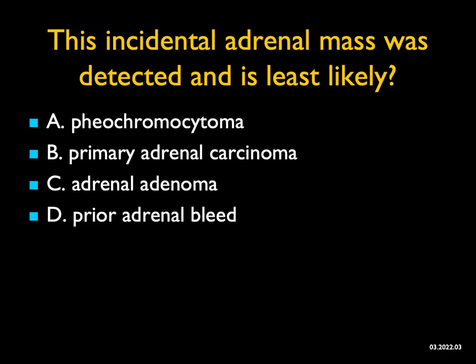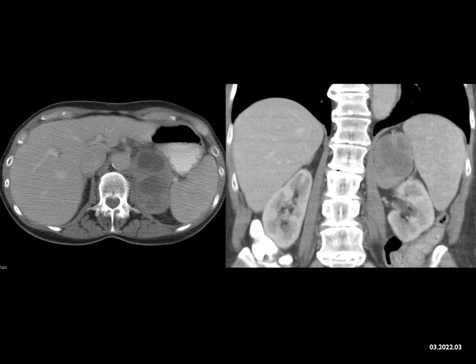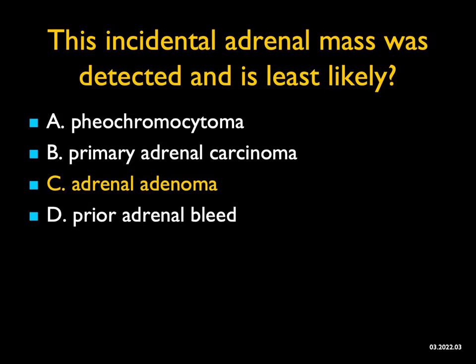The incidental adrenal mass was detected and the question is what is least likely. I see a large, complex, solid and cystic lesion in the left adrenal gland. My best bet would be maybe a cystic pheo, but it's not very vascular — though this is not a great injection. A primary adrenal cortical carcinoma is a good possibility. A prior bleed — cystic, low-density — if you had an adenoma that bled or some other lesion that bled, that would not be bad. The least likely thing to me is an adenoma. Adenomas are smaller; I don't see adenomas as a complex cystic lesion. So the least likely diagnosis in this case would be an adrenal adenoma.